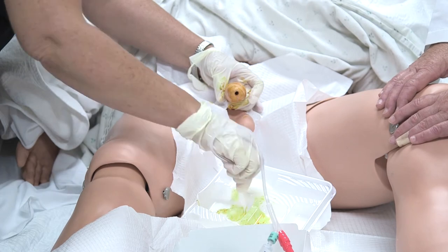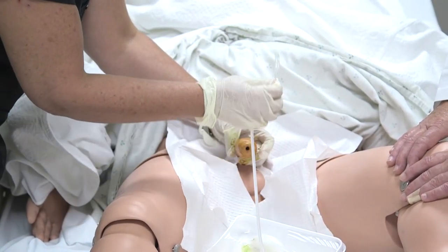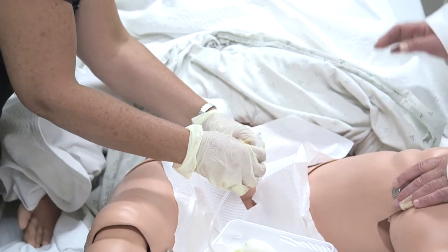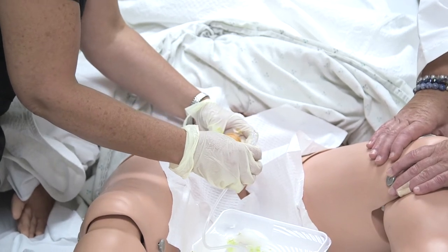I've got a lot of lubricant on there. You want to do at least 5 to 6 inches of lubricant. And then I'm going to have Tim take a couple of deep breaths in and out. And when I'm ready to go, I'm going to tell you to exhale, okay? Breathe out. So in and out.